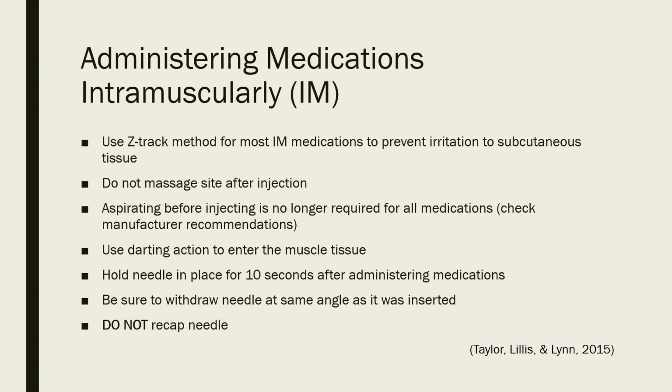And it's no longer required to aspirate back, but you want to check the medication manufacturer's recommendations before you decide whether or not you're going to aspirate back. But generally, you do not have to aspirate.